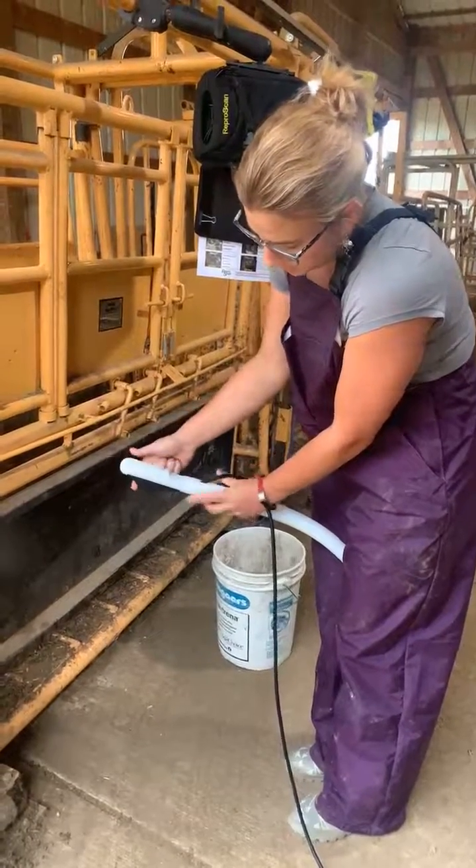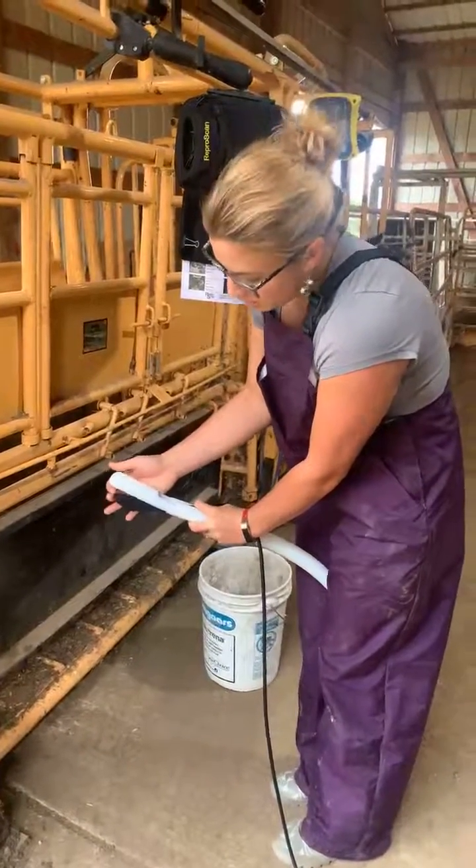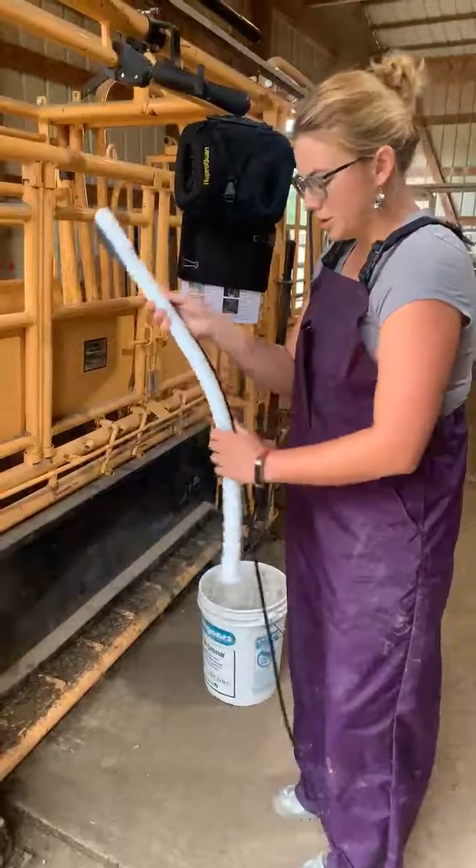If I'm not putting any pressure there, I can pop it back out. So I'm pulling with my index finger, popping it in, and then putting the probe into the groove.